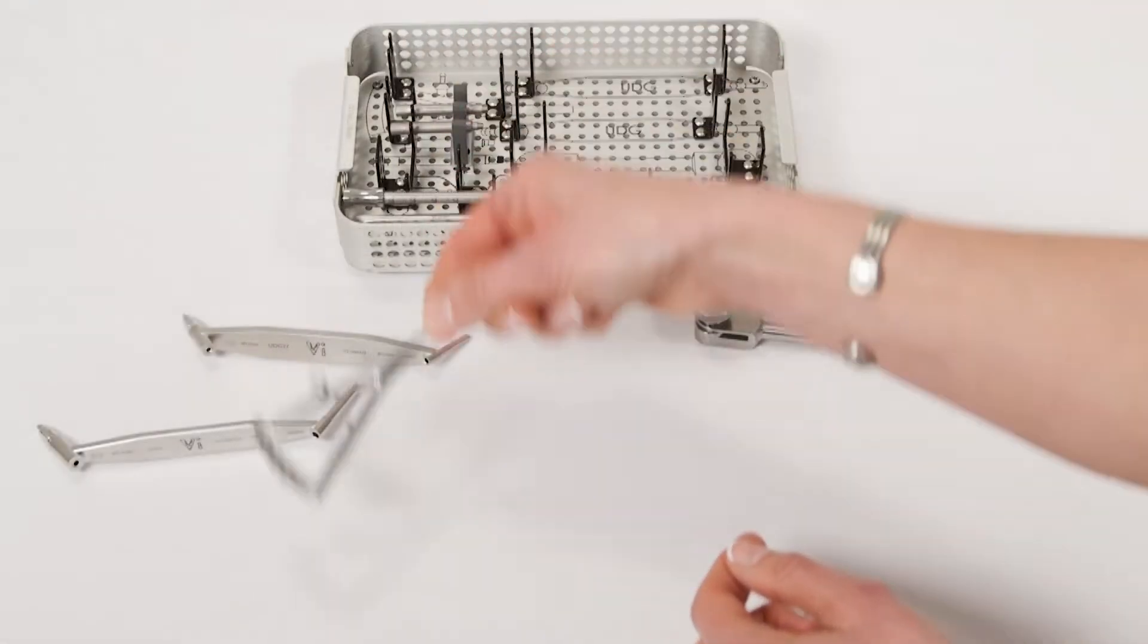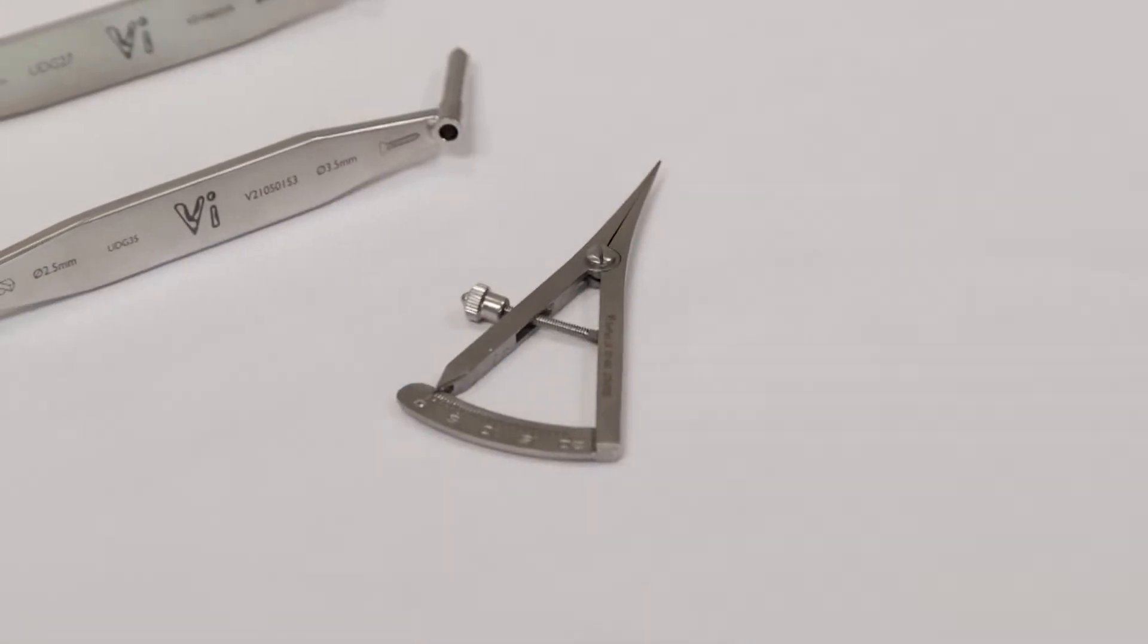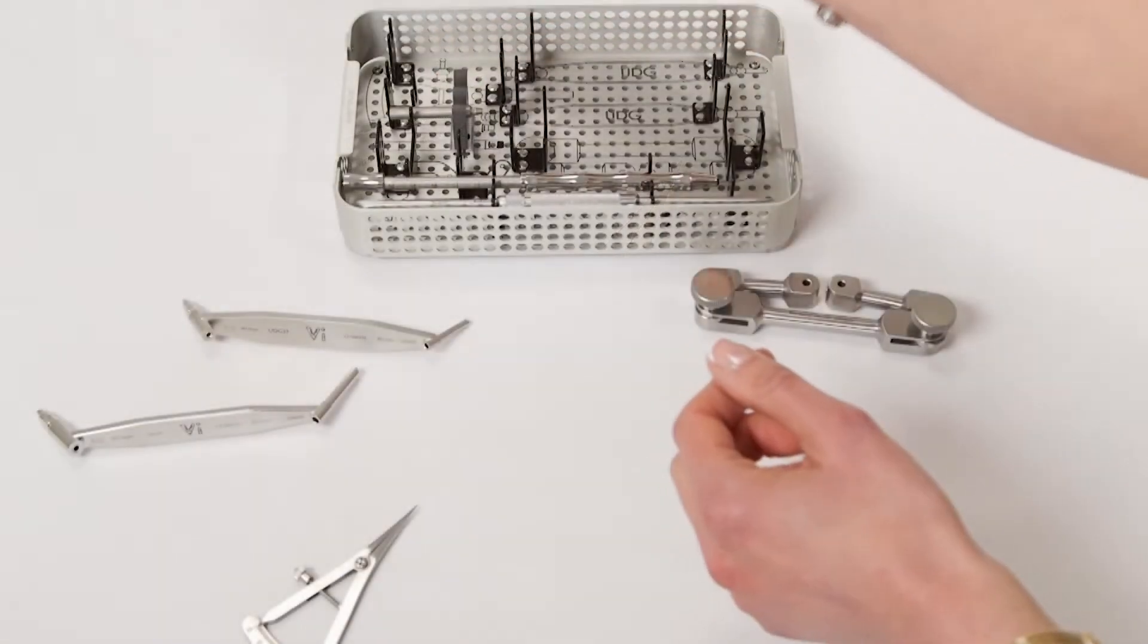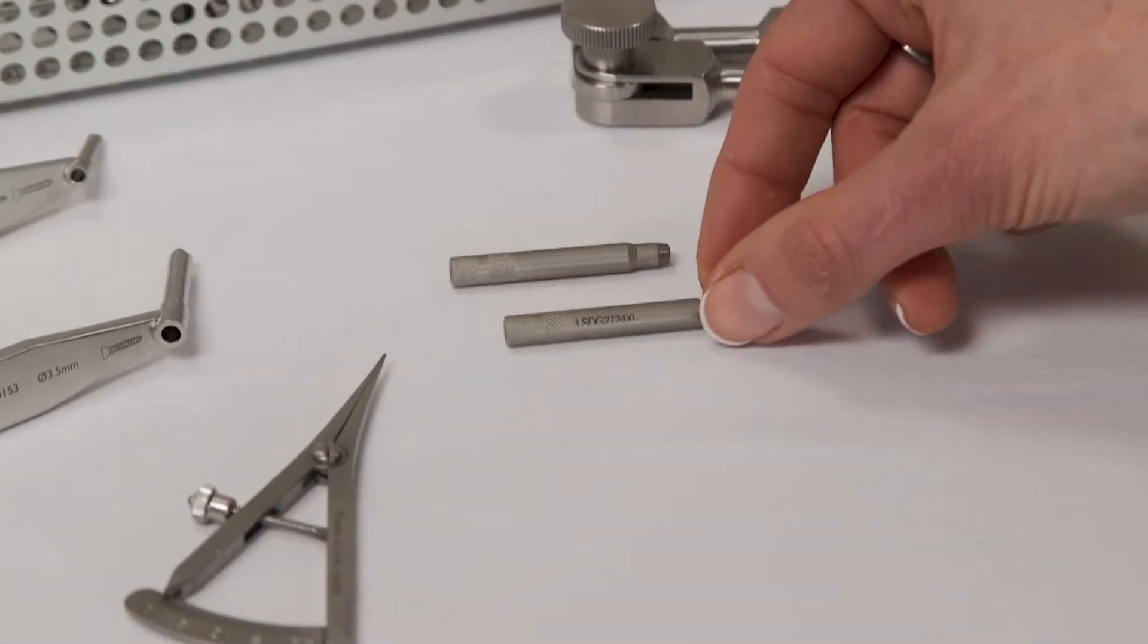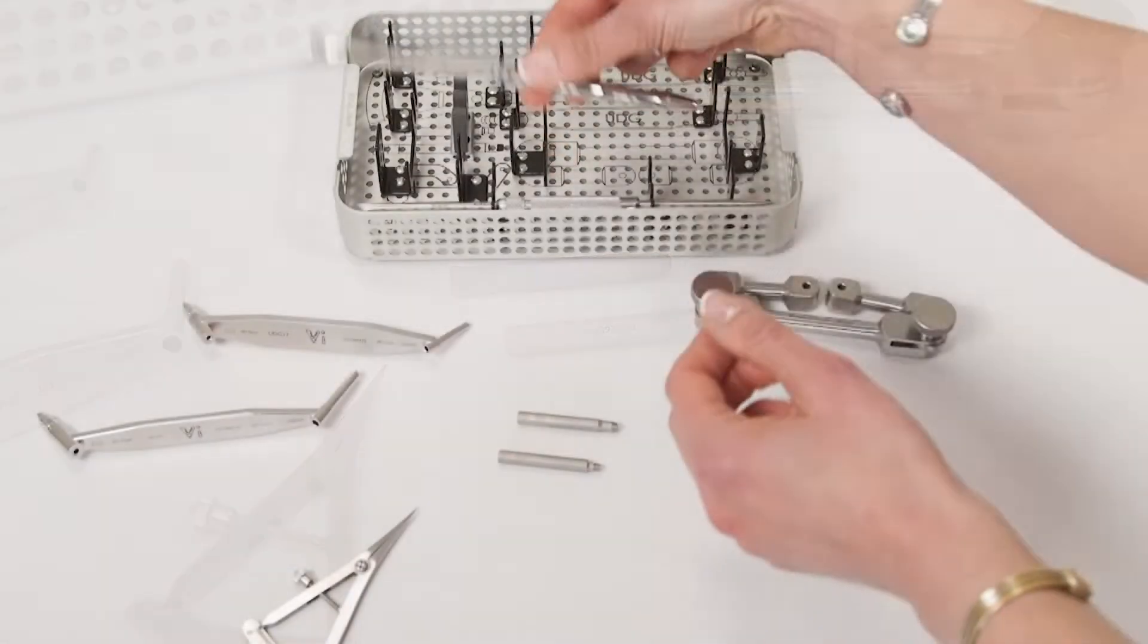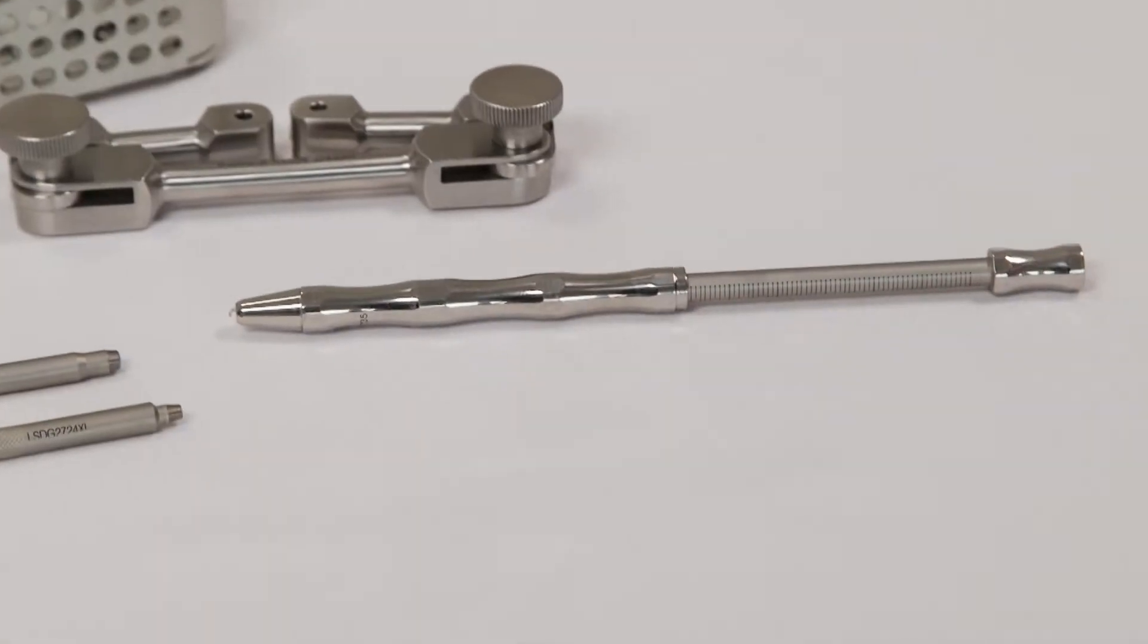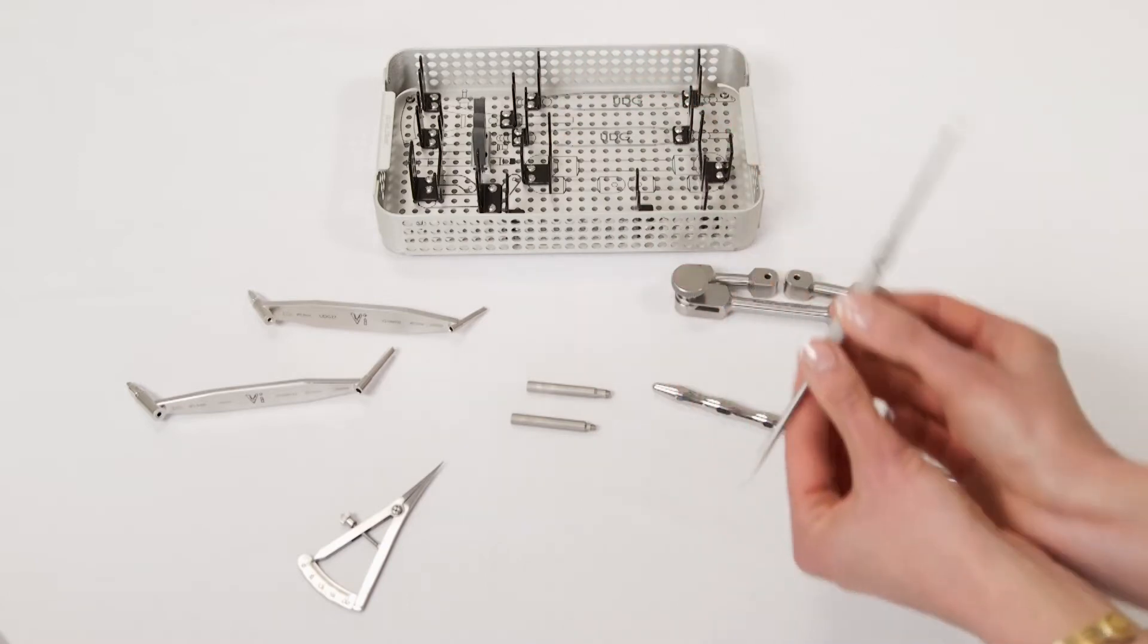Additional instruments include a TPLO Rotational Gauge Divider, Locking Screw Drill Guides in both sizes, a Depth Gauge, and a Bone Scribe.